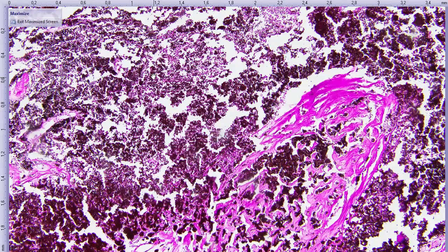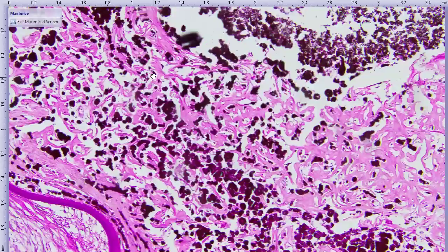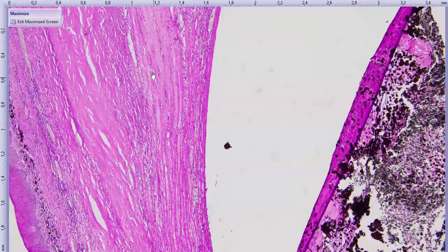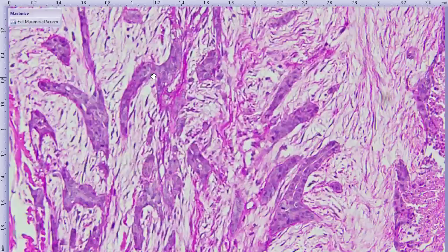And there's a population of cells towards the left, maybe the non-pigmented portion that's in the cornea. Yes, these are the beautiful ones in the pigmented portion, the more necrotic one. And they want to see the non-pigmented portion as well. Yeah, probably. So here's that one in the corner. Here's that part that has more of the scirrhous response.